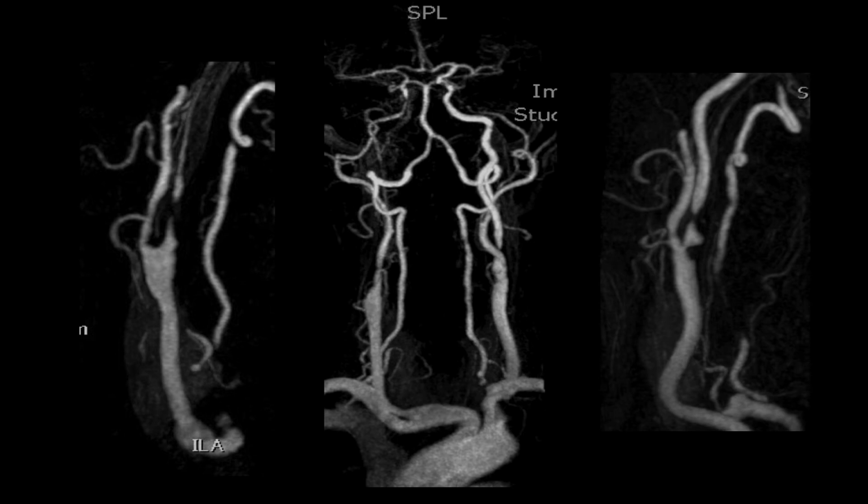So now we can move on and not only look at the lumen from aortic arch to circle of Willis. In this patient who's got bilateral stenoses, you can see as you travel up on the near image, there's a very thin internal carotid with a bit missing, which is not a complete occlusion, but shows there's a very tight stenosis. And on the other side, a similar appearance.